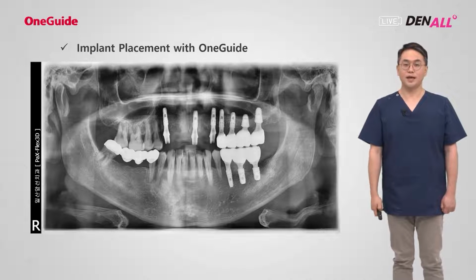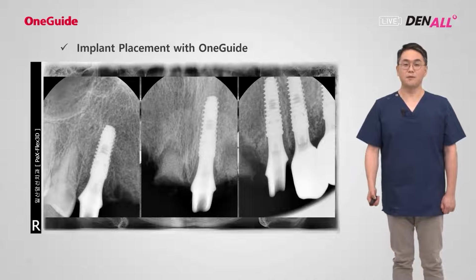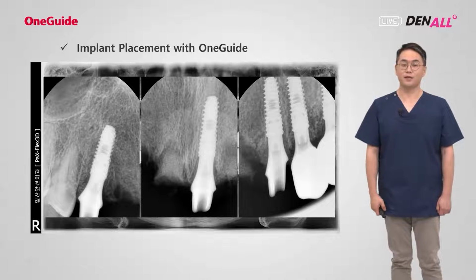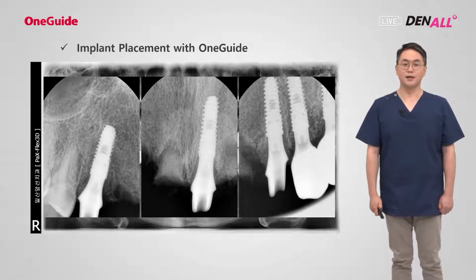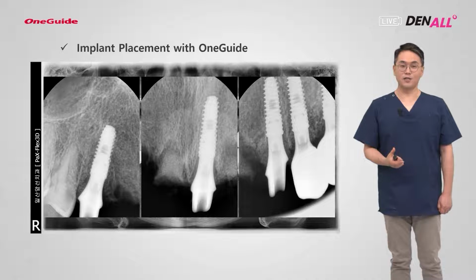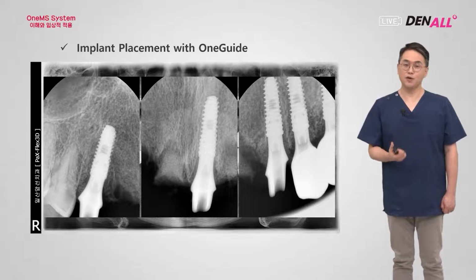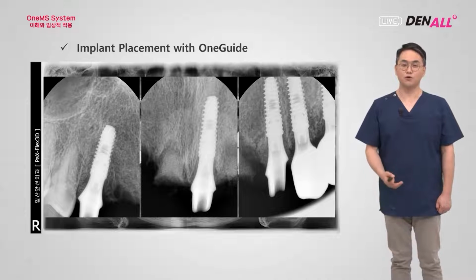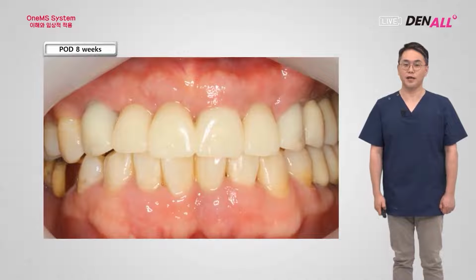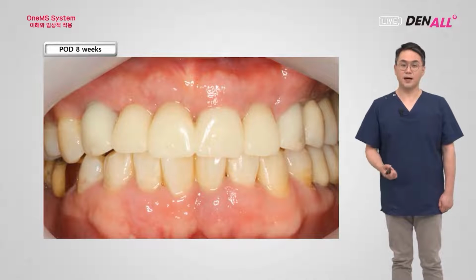Now, after surgery, this is the panorama photo, and this is the PA after surgery. As you can see, the prefabricated abutments are placed very well. Now, without opening a flap, using the abutment and temporary that you prefabricated, you can have an excellent gingiva feeling and the patient will feel less uncomfortable. This is 8 weeks post-op.